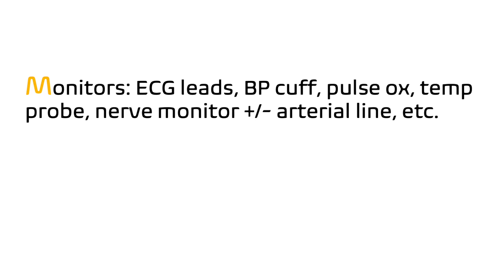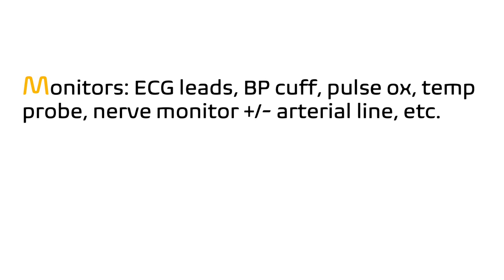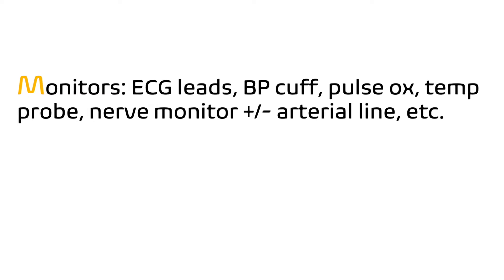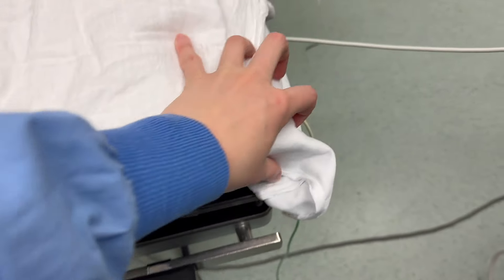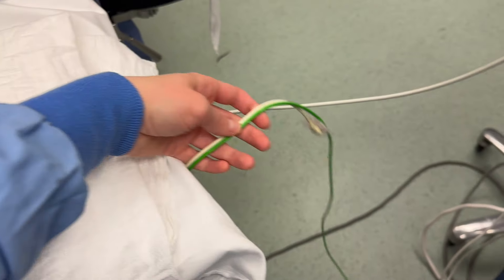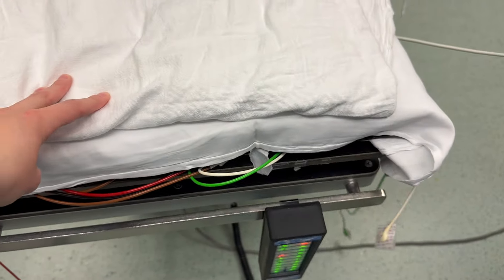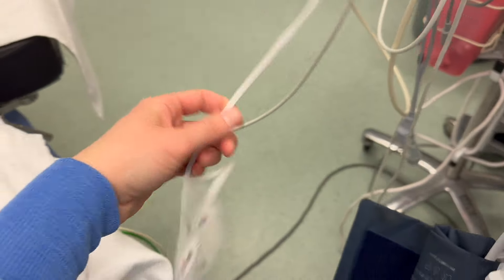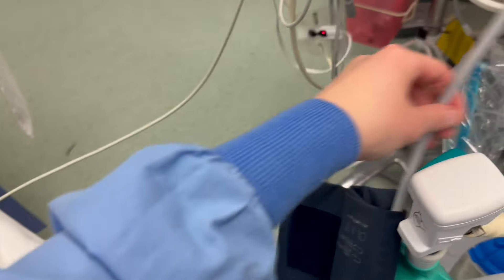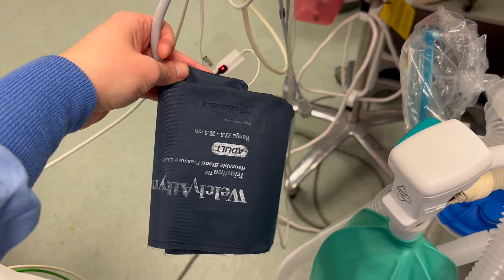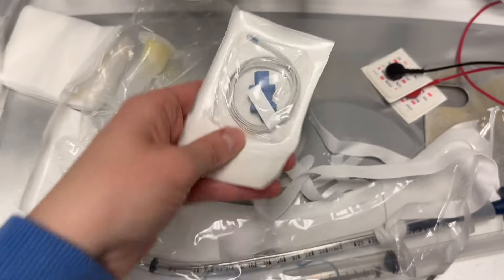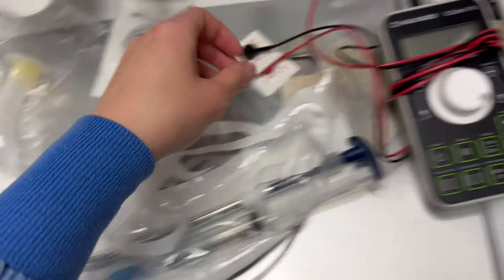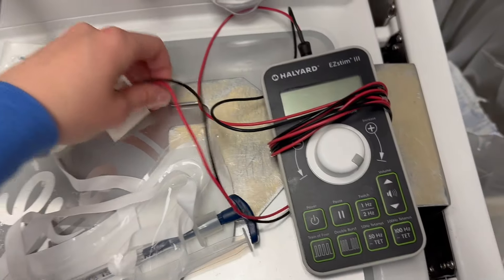The next step in setup is M, which stands for Monitors. This includes your ECG leads, blood pressure cuff, pulse oximeter, temperature probe, nerve monitor, plus or minus arterial line and other monitors. Here I have the ECG leads conveniently placed underneath the mattress and in prime position to attach to the patient. I have my pulse ox hanging nearby as well as my blood pressure cuff. I've chosen a nasal temperature probe for the case, and I have it here as well as my nerve monitor.